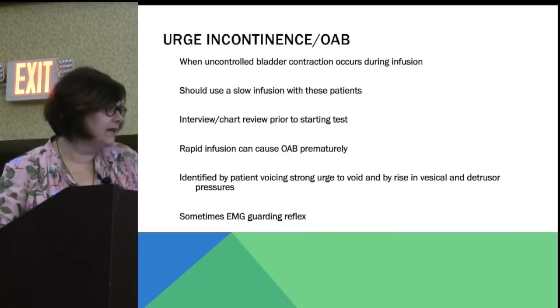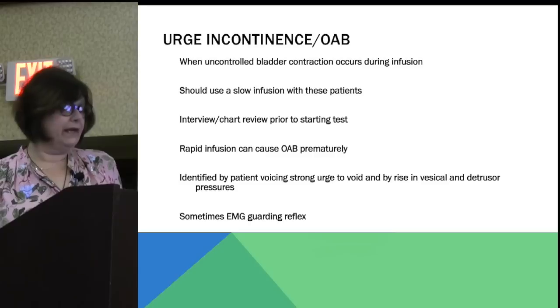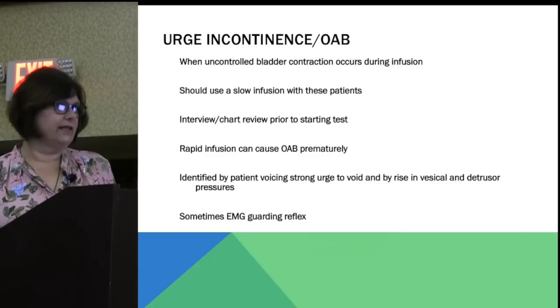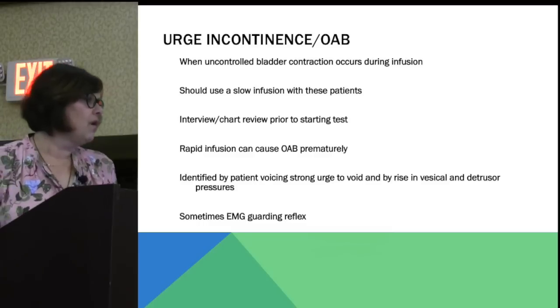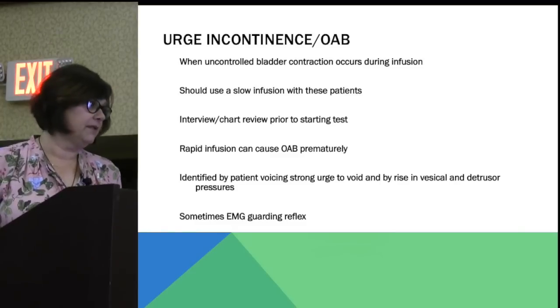All right, so urge incontinence, what really is it? It's an uncontrolled bladder contraction, and it can occur during the infusion. That's kind of what we're looking at. As we're filling the bladder, we want to replicate what's going on in your daily life, your daily complaints. We want to see that happening here. So it's an uncontrolled bladder contraction. We're not asking the patient to void. All of a sudden, this big spasm just happens.